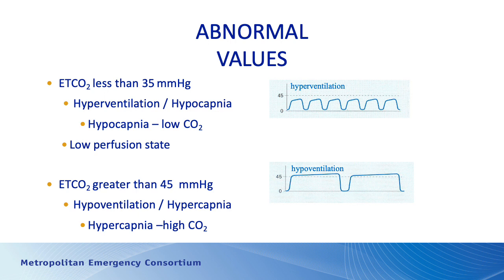It results in what we call hypocapnia, which is the low CO2. You can also see this in low perfusion states too. So in terms of the CO2 level, it will be low. So low perfusion states can also give you a pattern that looks like this.